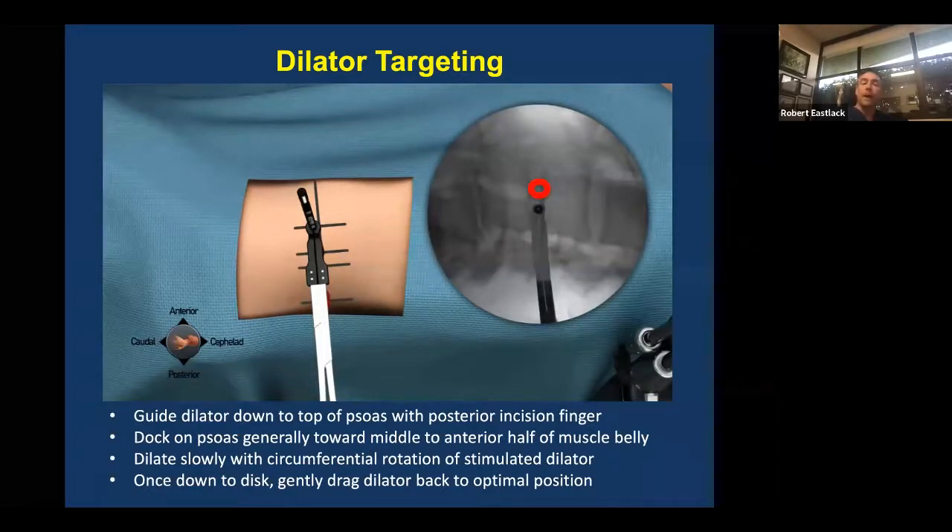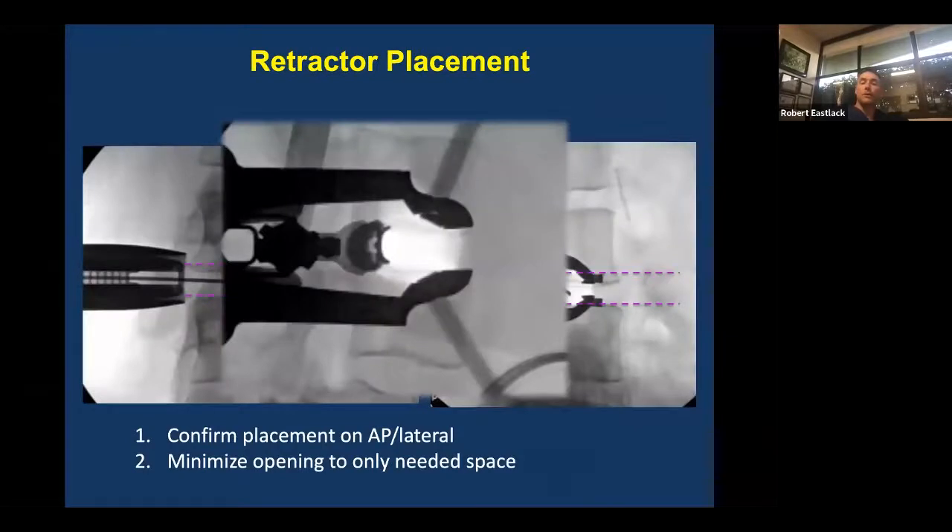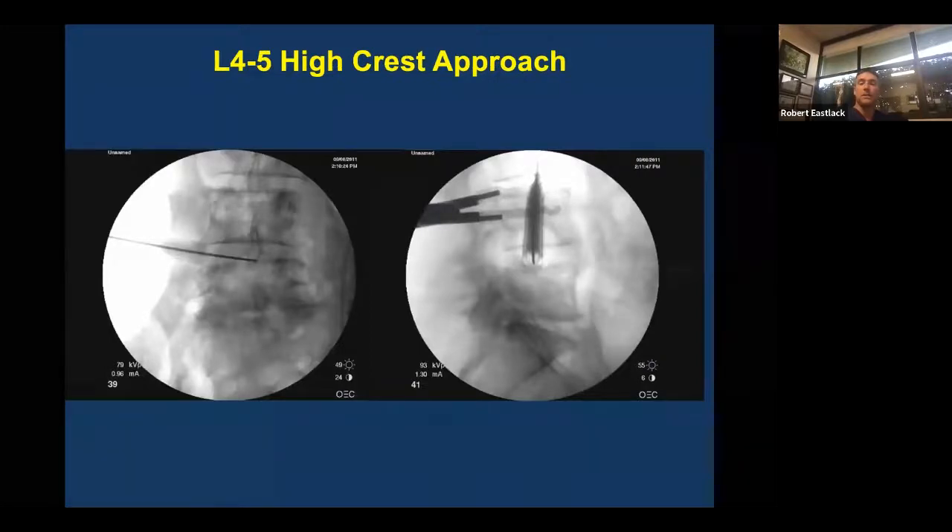Once you have both incisions carried out, you guide your dilator down. Typically aiming slightly anterior at L4-5 — in this case I would aim even farther anterior through the psoas, maybe a bit cephalad to avoid the lumbar plexus, get in front of it and then drag back once you're through. Once you're docked and have done your stimulation, guide wire placement, and dilation, you want to place your retractor. This is a good retractor placement providing ample space to do your discectomy and open ventrally. After placing your fixation of the posterior blade, here's a look at an angular approach at L4-5.